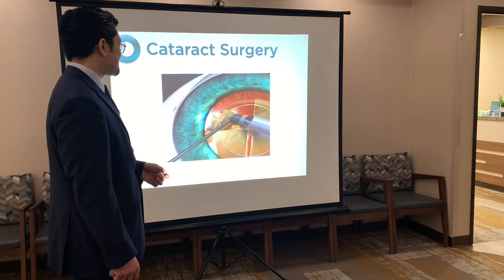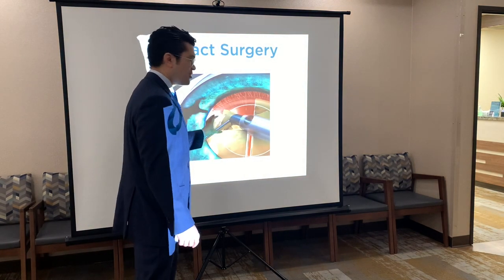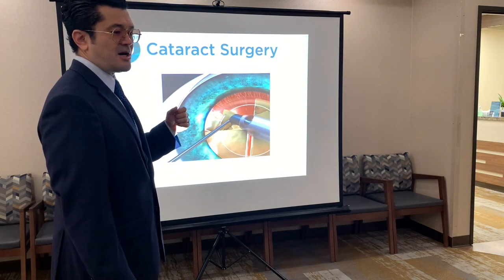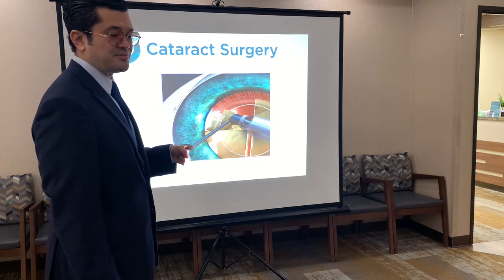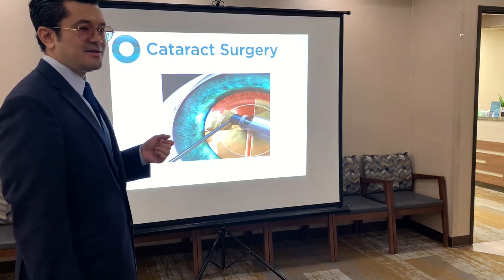There we go. You can see those little pieces of cataract now. The phaco emulsification probe is going to grab that piece and then apply ultrasound energy to break it up, or emulsify it, and then it's aspirated as tiny particles.